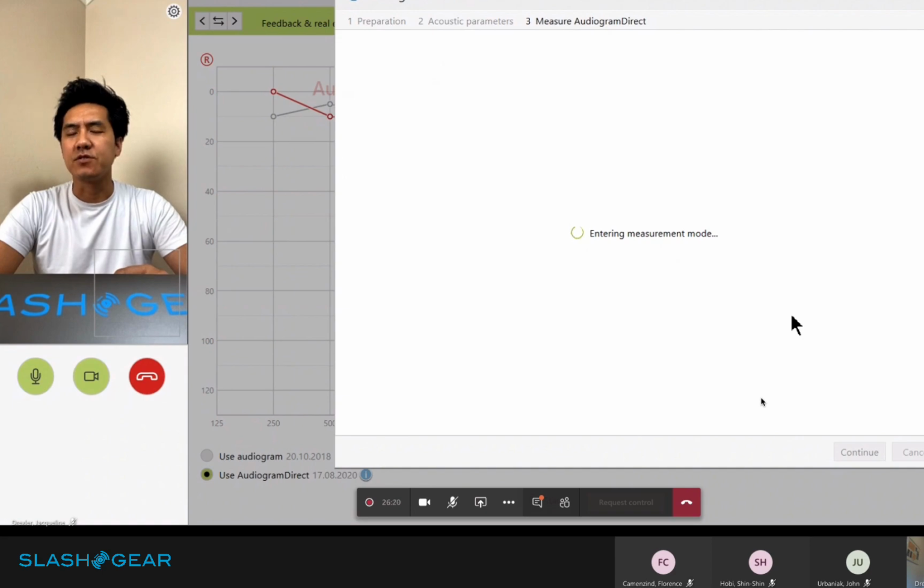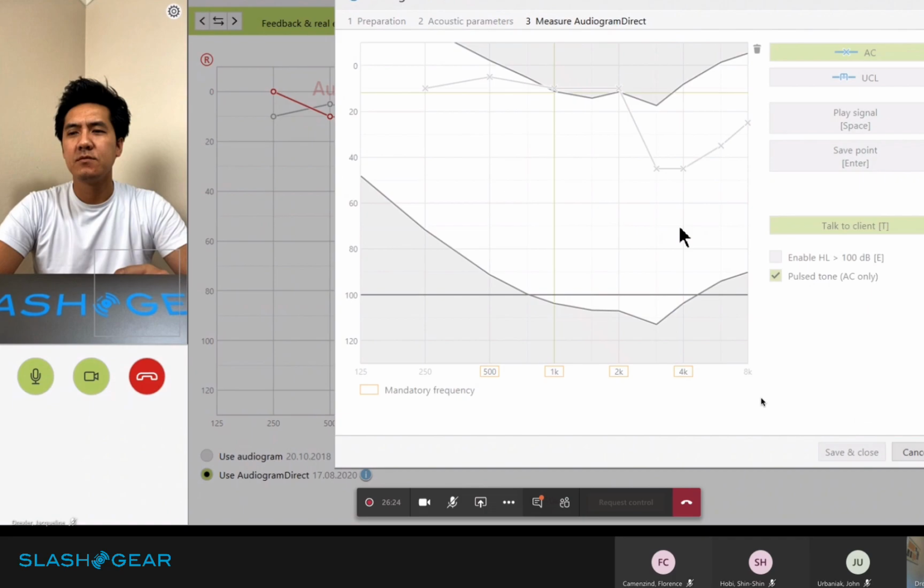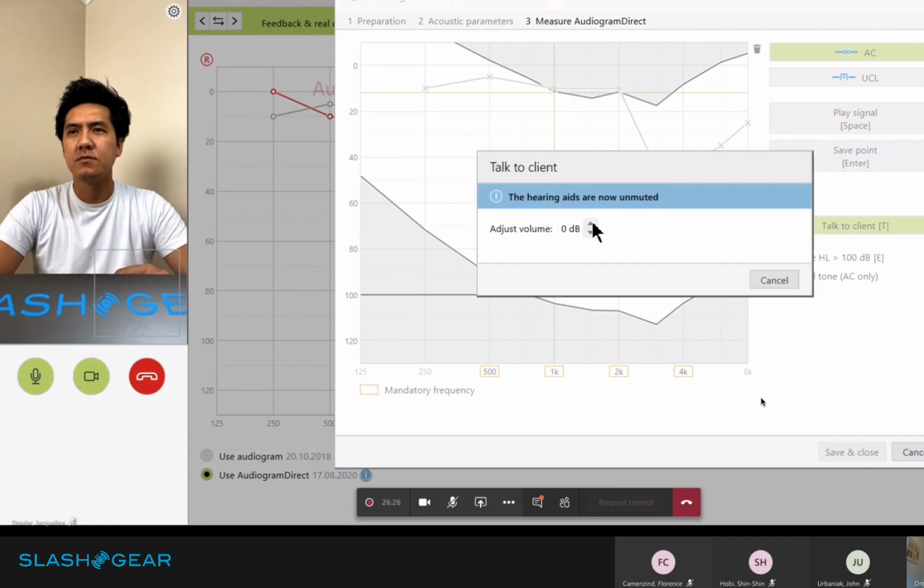Have you started? Okay, so we'll now begin. Okay.